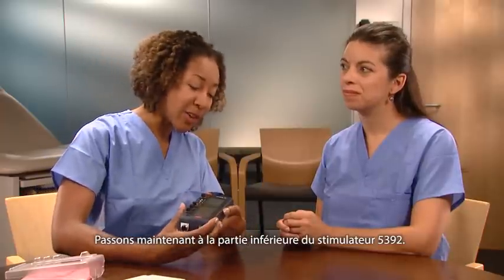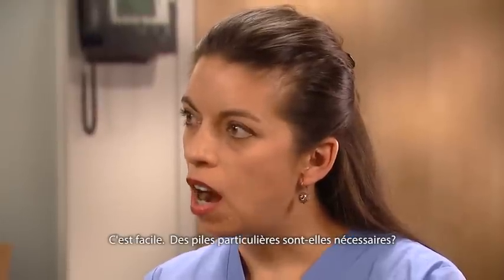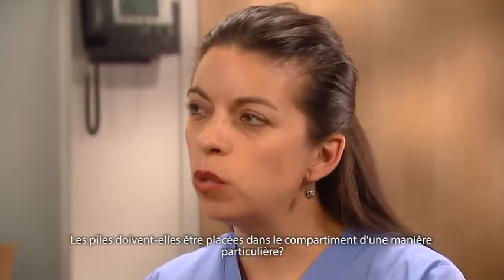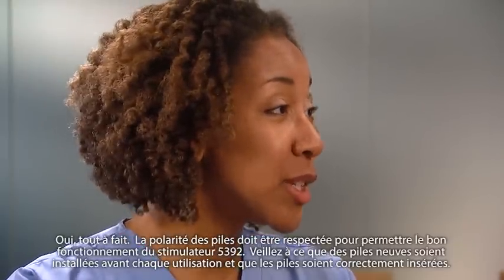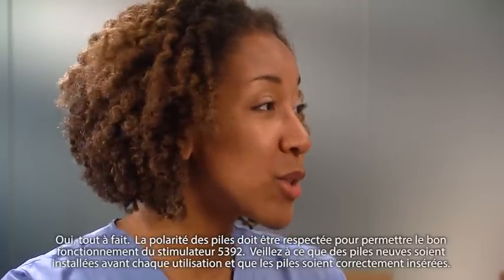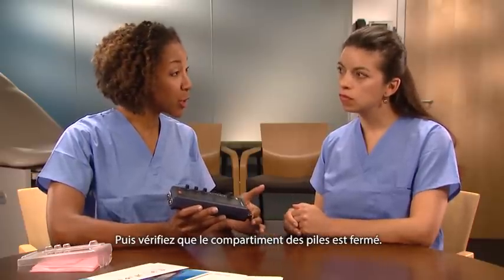Now let's look at the bottom of the 5392. Just press this button and the battery drawer opens. Are there any special battery requirements? Just make sure you use two standard AA batteries. The 5392 requires proper battery polarity for operation. Ensure that a new set of batteries is installed with each use and that the batteries are inserted correctly, by verifying alignment with the polarity markings on the inside of the battery drawer. Then make sure the battery drawer is closed.